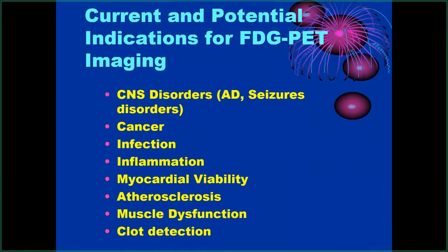So it's just amazing how this compound that was initially started as a research tool at the University of Pennsylvania now has become a major modality in medical imaging.